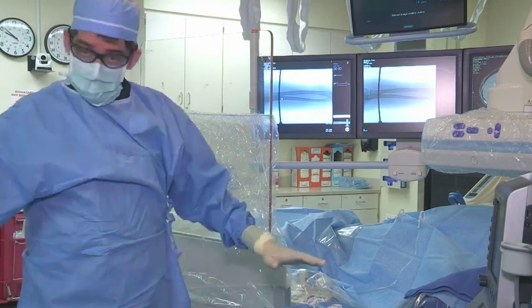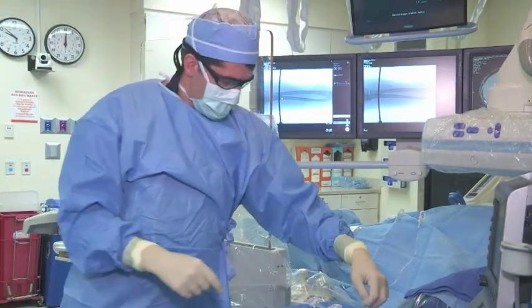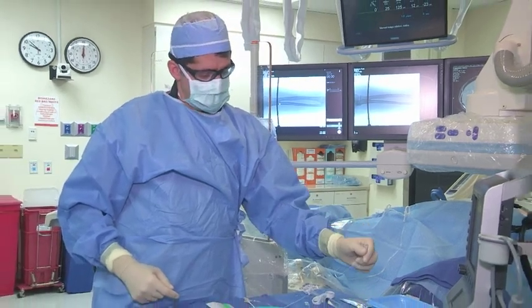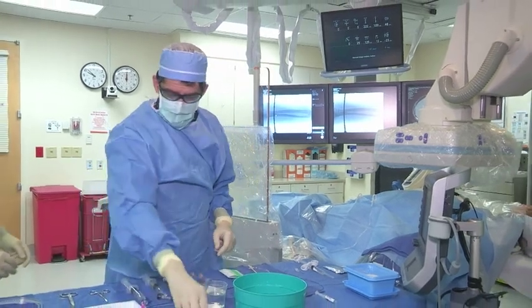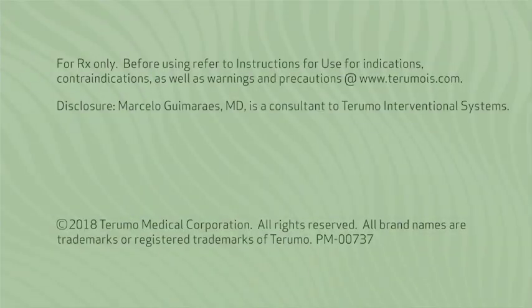We have all the tables set up in sequence, including the wire. The wire is already pre-mounted so we don't have any waste of time when you get access in radial. That's critical to obtain successful radial access. Let's go to the station.